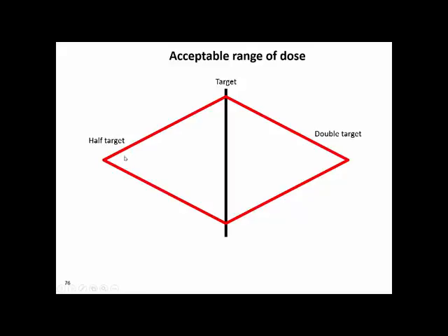100 might be a reason to repeat. So we have an area within this picture that is very acceptable, marked in blue, where we would not recommend to do any repeat or to expect any problem with the image. Now here in this area, when we go closer to the lower limit, we recommend to check for the noise in the image, not necessarily immediately repeat this image, but check for the noise, look at the image very closely, and then decide on an individual base, do I have to repeat this or not?